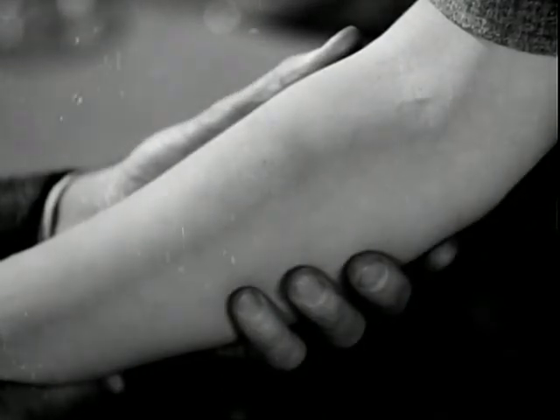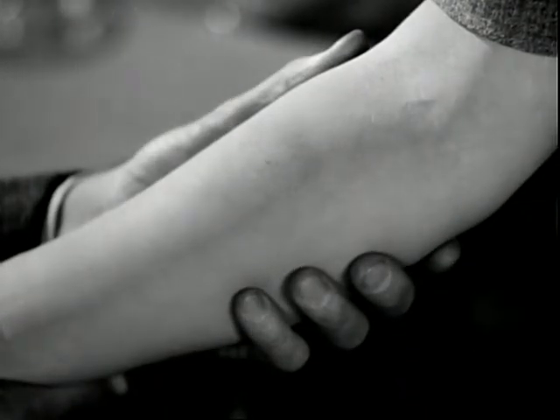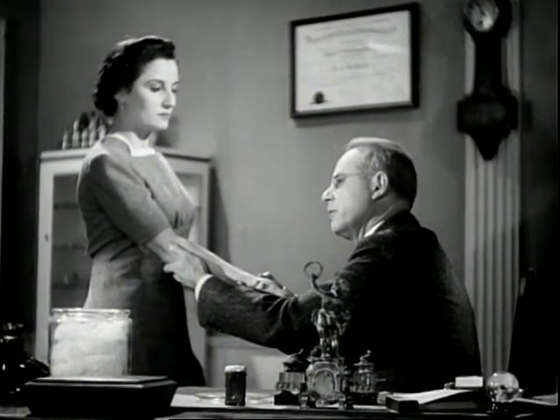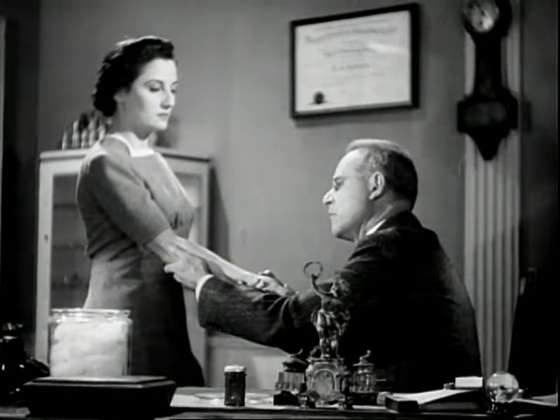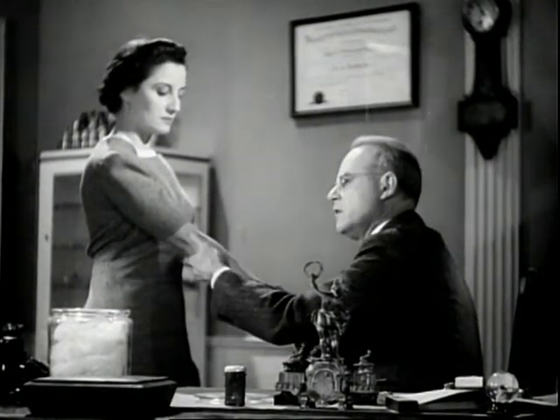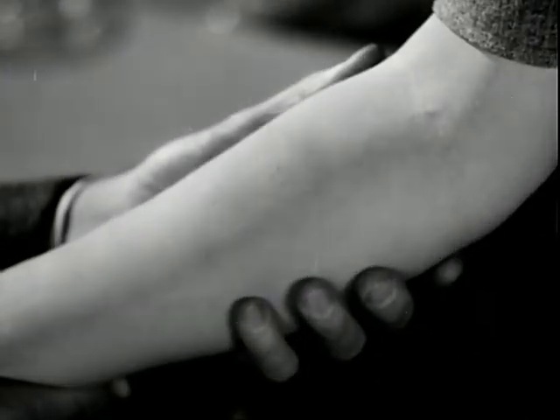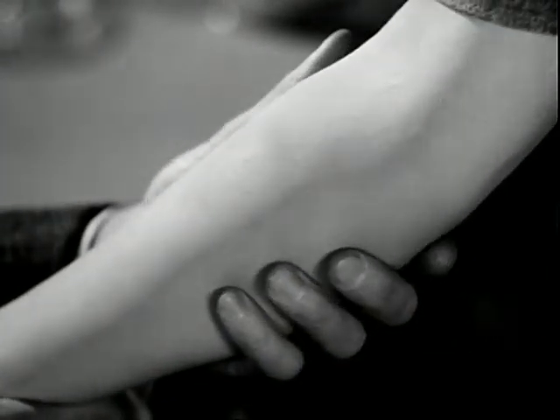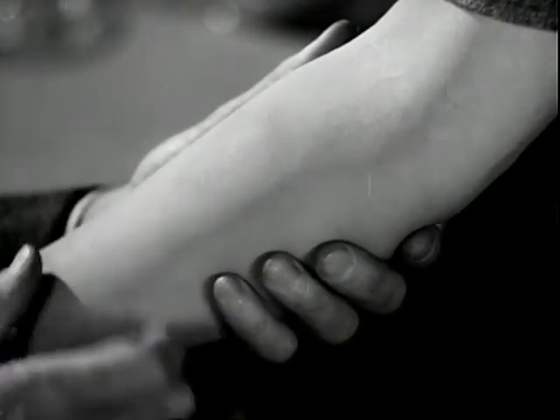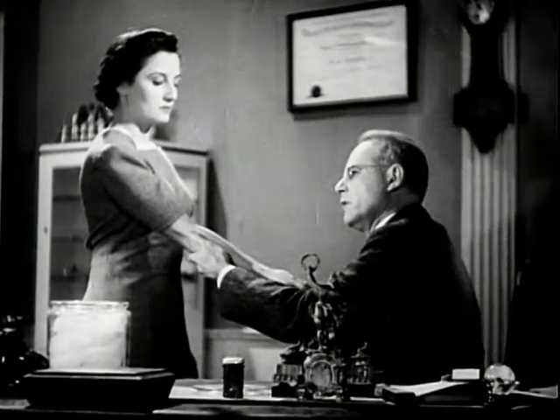The test is read in 48 hours. Hold the arm in a good light and flexed a little at the elbow. Taut muscles may obliterate the reaction. Look across the arm rather than down on it. A positive reaction is one that shows edema and redness of varying degree. If there's no edema, the reaction should be considered negative. When in doubt, pass the finger over the tested area. Sometimes the induration can be felt when it cannot be seen.